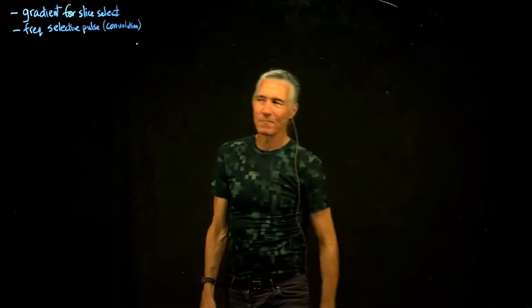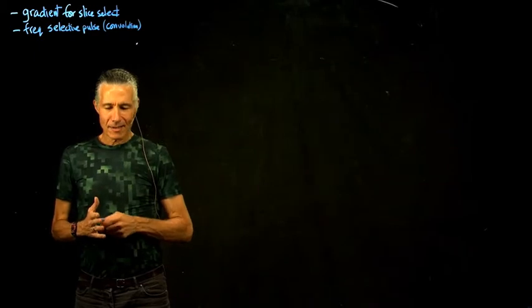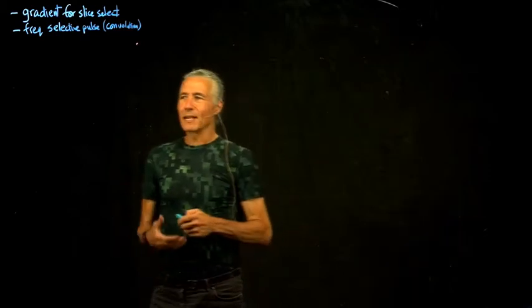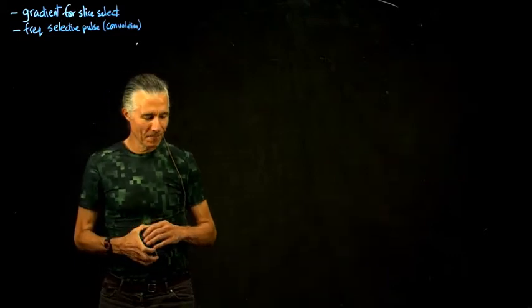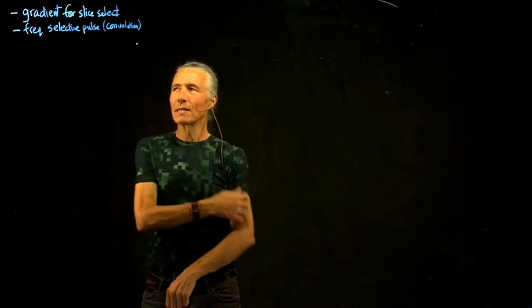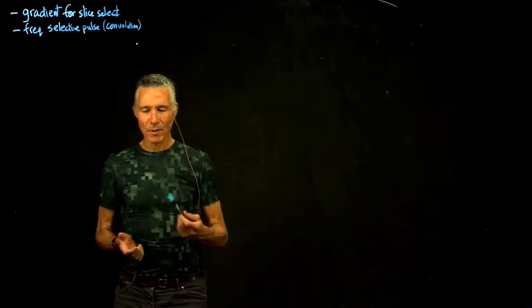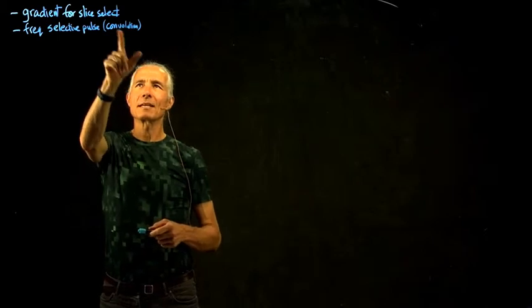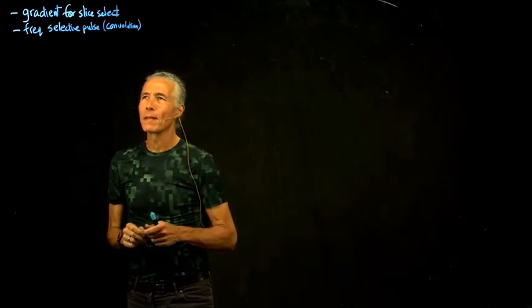Okay, so today we actually start with some of the actual MRI, getting slowly working in closer to actual MRI pulse sequences. And so today we're going to talk about how we can use a gradient for slice selection. The idea here is to try to just activate a thin slab of the brain.